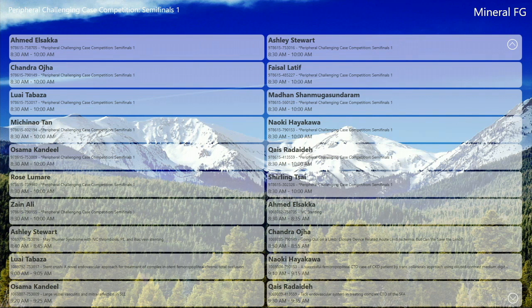You're using 10% diluted contrast, and then the thing you change in the actual digital subtraction picture is you go 1 frame per second. Is that the protocol? Frame was 3 per second. 3 frames per second. So the normal digital subtraction you showed in the middle with diluted contrast was how many frames per second?